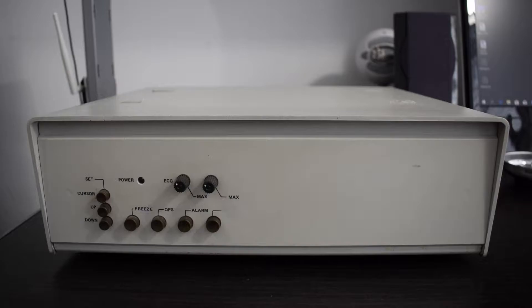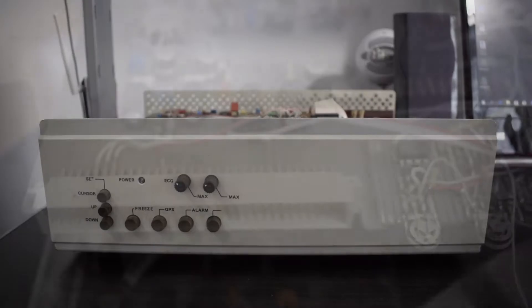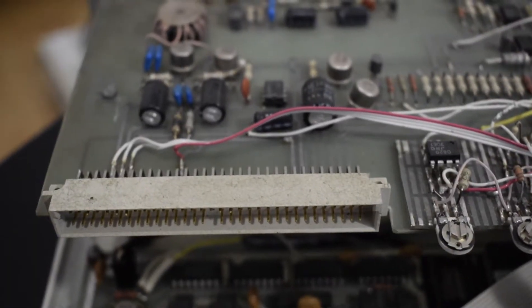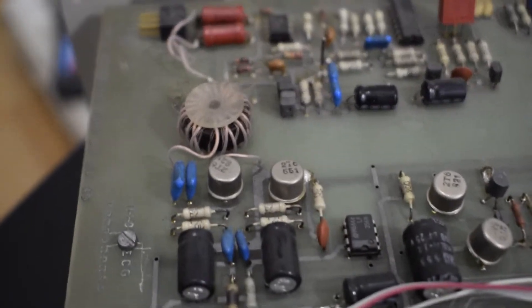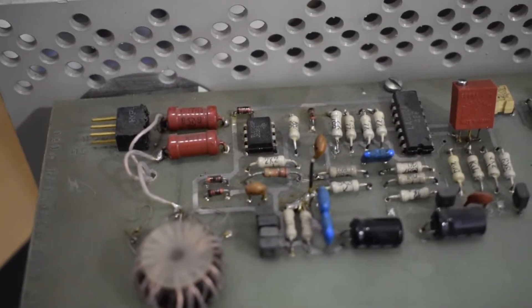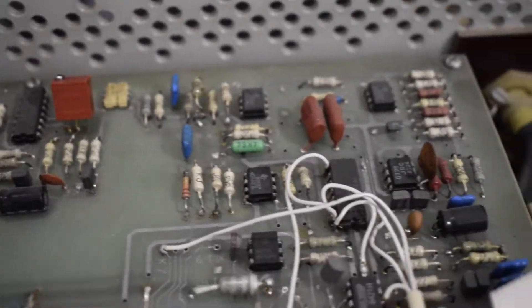Anyway, you know the interesting stuff is inside, so let's tear this baby down. Four bolts, two by two on either side, and voila — classical 80s inside: a motherboard and a daughterboard design. The motherboard actually looks great, but I cannot say that about the daughterboard — many bodges, literally hundreds of them.